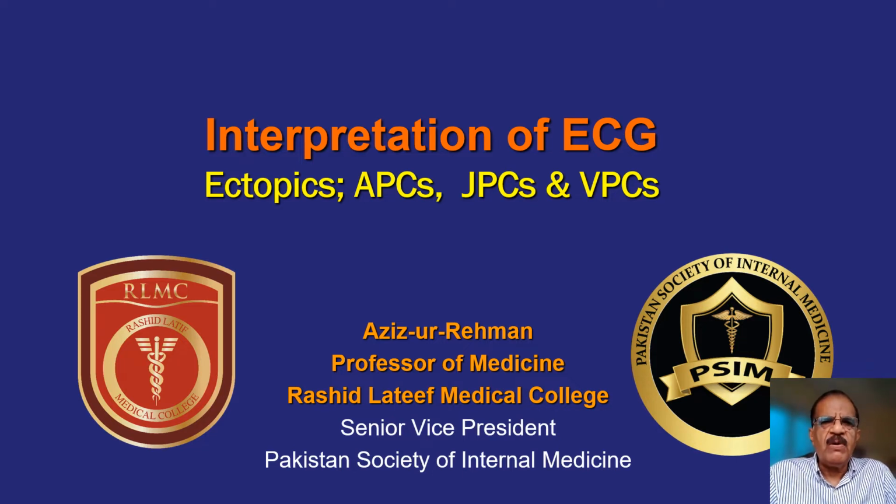Initially, I thought I will do separate videos for these three, but then I thought since the basic concept is the same, and then I have to give you example to differentiate one from the other, so might as well cover all these three types of ectopics in one module. So this will be a little lengthy, but I think that will cover the entire concept of ectopics.